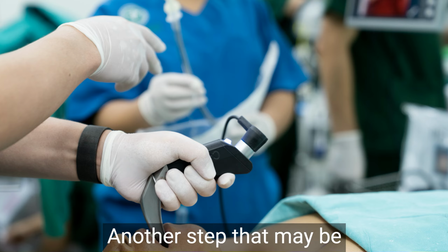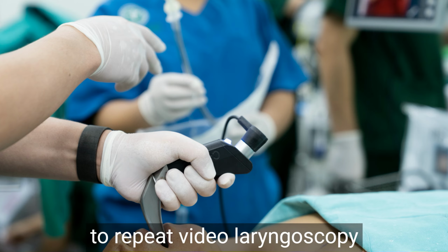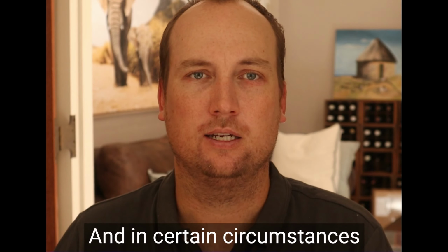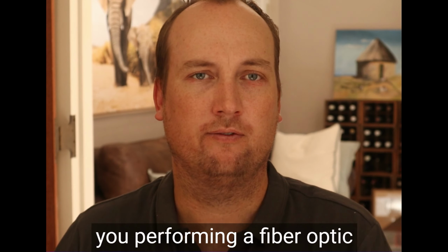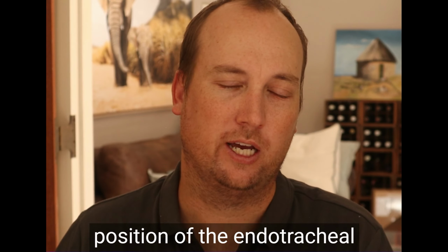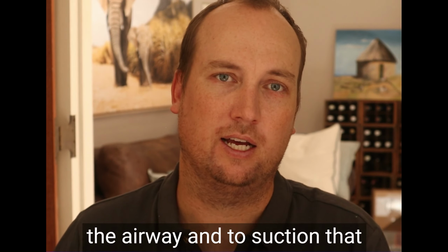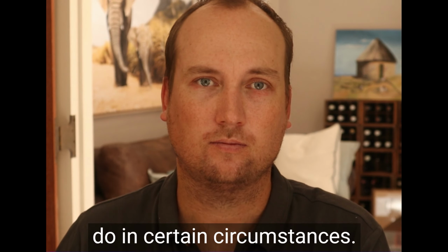Another step that may be required during this process is to repeat video laryngoscopy to confirm the depth and placement of our endotracheal tube, and in certain circumstances, if you have it available to you, performing a fiber optic examination to confirm the position of the endotracheal tube relative to the carina, to look for foreign material in the airway and to suction that out, is also something that I do in certain circumstances.